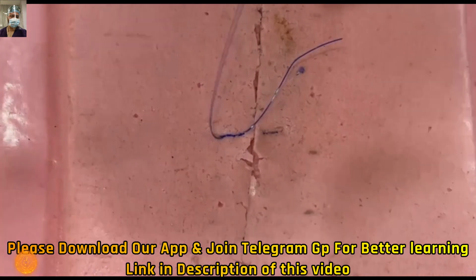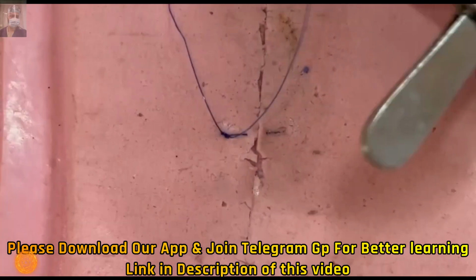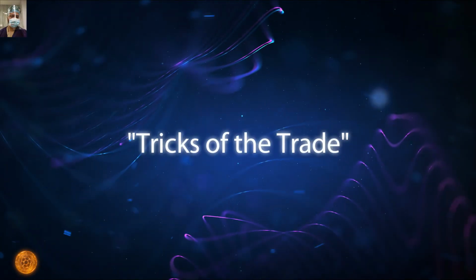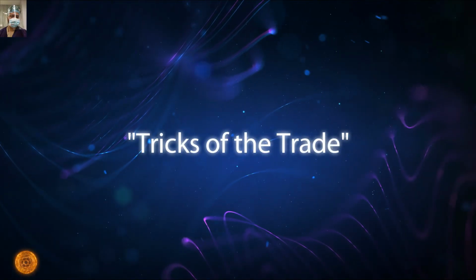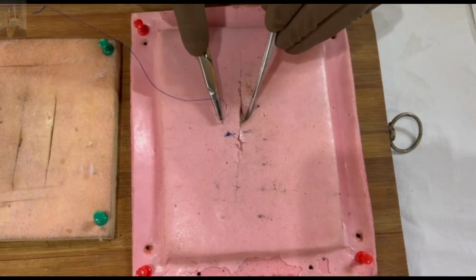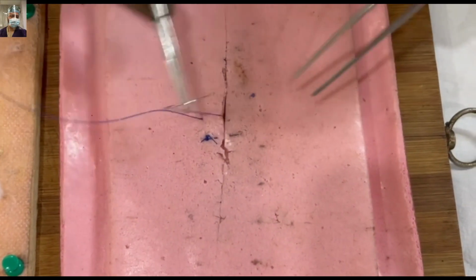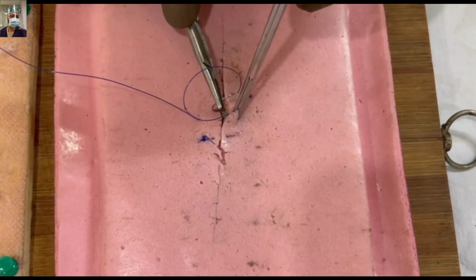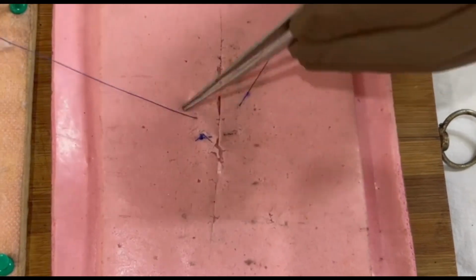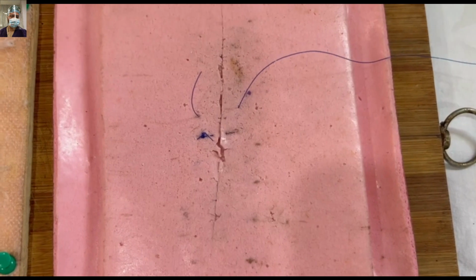So I have taken lesser tissue. If I take even lesser, then it will give a better cosmetic result, and the tension distribution will be the same. Another trick of the trade for you guys: look here, I'm demonstrating for the sake of demonstration that if I take too much tissue in the near bite, then it creates a sort of strangulation effect. So just remember, don't take more than 2-3 mm, maximum 2 mm, in the near bite.